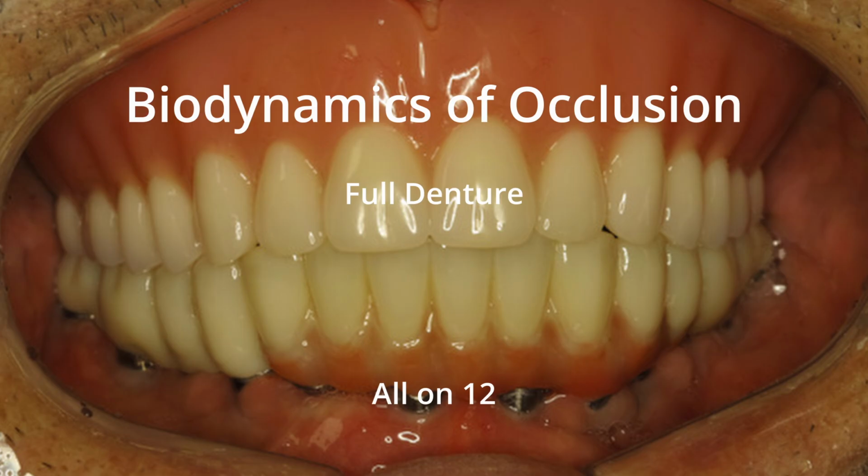If the mandible is restored with zirconia prostheses and the maxilla with a removable denture, no significant problems occur in the mandibular implant prostheses. What happens to the maxillary removable denture? It wears down. Severe occlusal wear occurs on the resin denture teeth in the maxilla. The mandible has zirconia while the maxilla has resin teeth. Wear of the resin teeth increases 2 to 4-fold.